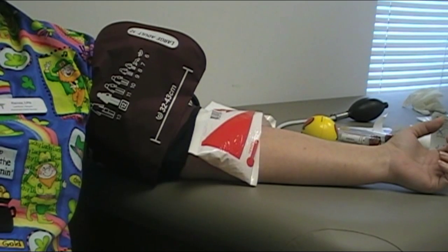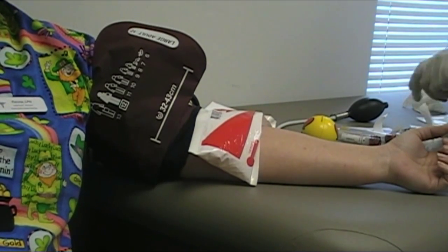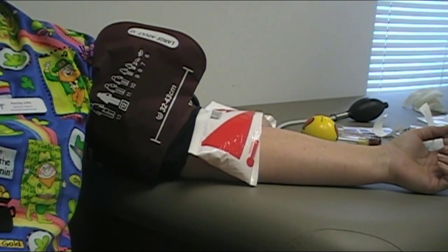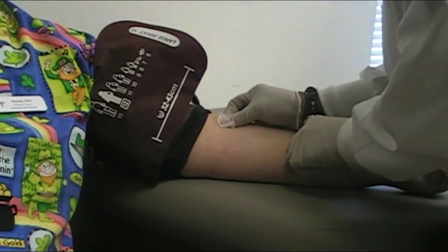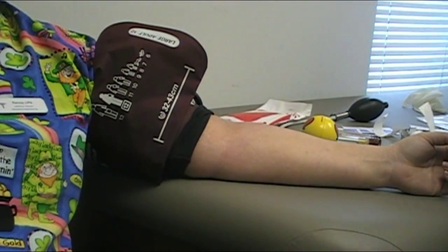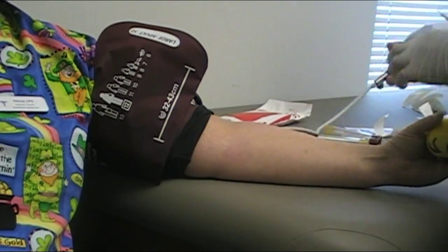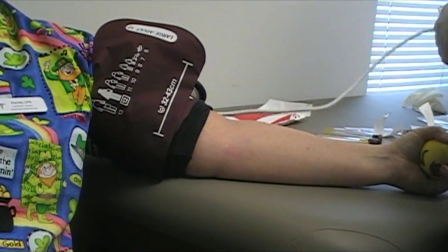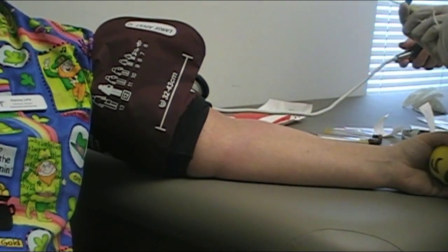We're going to use a 10cc syringe to draw these labs instead of the vacutainer tube, because quite often the vacuum inside the tube is too great for the blood vessel you're trying to draw from, especially on smaller veins. We don't find that problem as much in our larger folks, but with smaller veins like the back of the hand, you don't want to use the vacutainer alone. The goal is you can control the amount of vacuum exerted on the inside of that vein. Okay, let's take off the heat pack and clean the area with alcohol. Then pump up the blood pressure cuff to about 85 or 90.